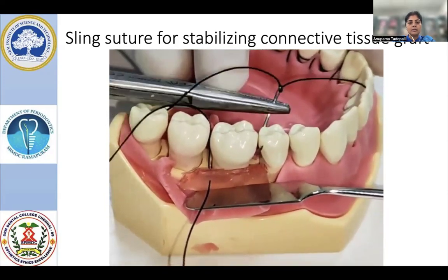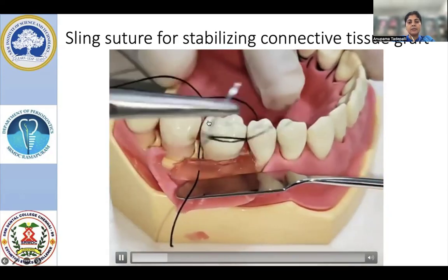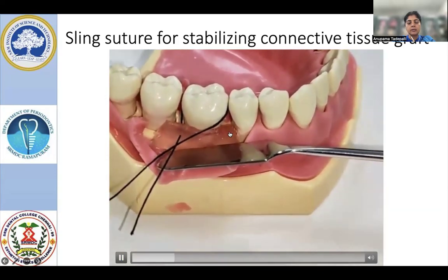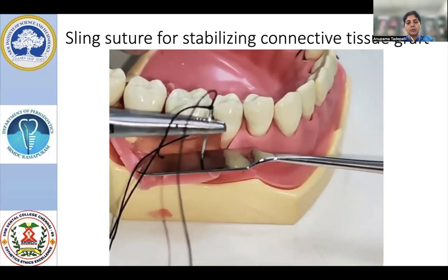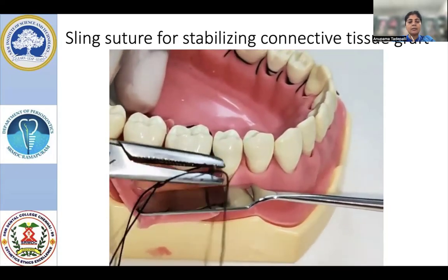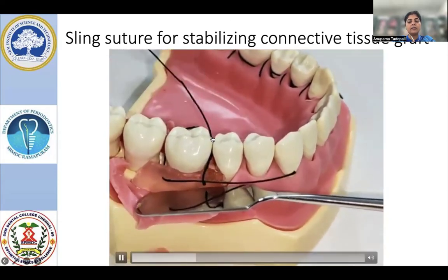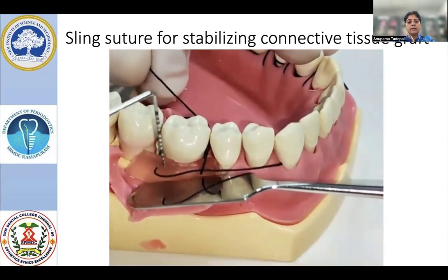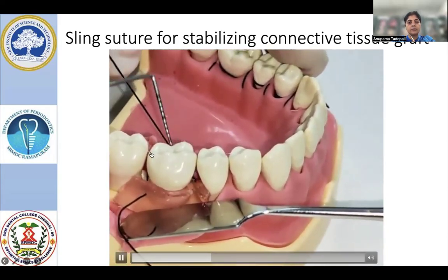What we do is: we will be taking the bite in the first interdental area and we will emerge onto the lingual side without any tissue bite. Then we will go to the next interproximal area and take the second tissue bite. You will be taking bites only on the facial aspect, especially from the connective tissue graft. When you are emerging from the lingual side, make sure there are no tissue bites on the lingual aspect. Once you finish taking bites in both interproximal areas, you will come back to the first interproximal area.